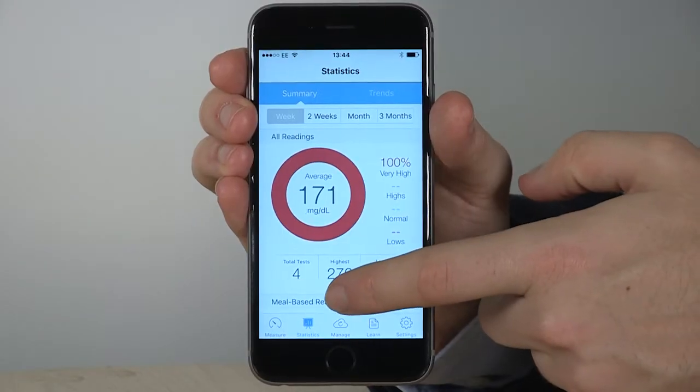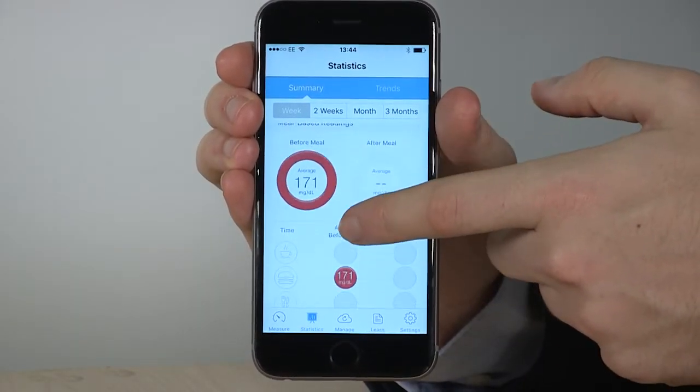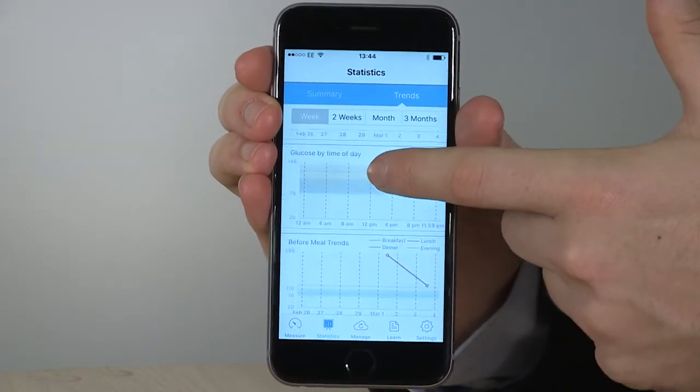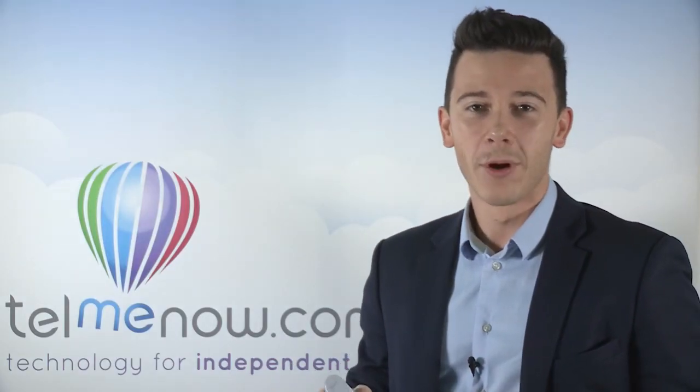What I love about the app is how it summarizes your results over time and allows you to spot trends before and after meals, so that you can optimize the method by which you manage your diabetes. This might include your diet, which you can log in the app, or with your insulin.